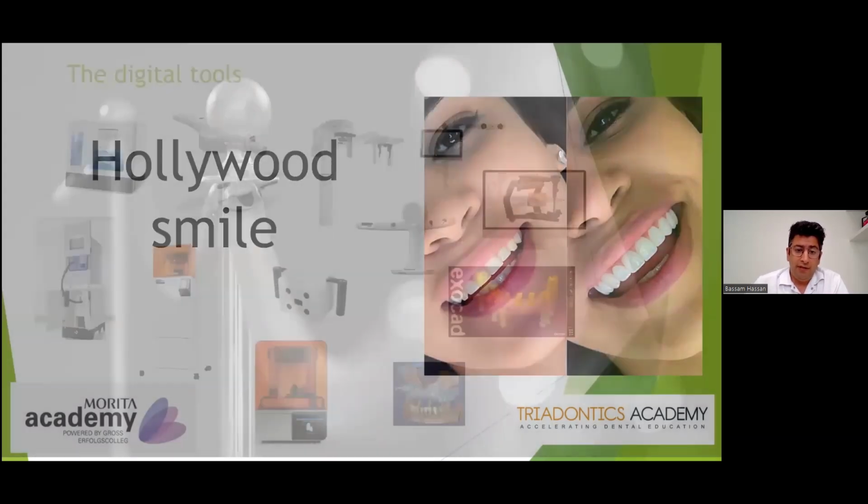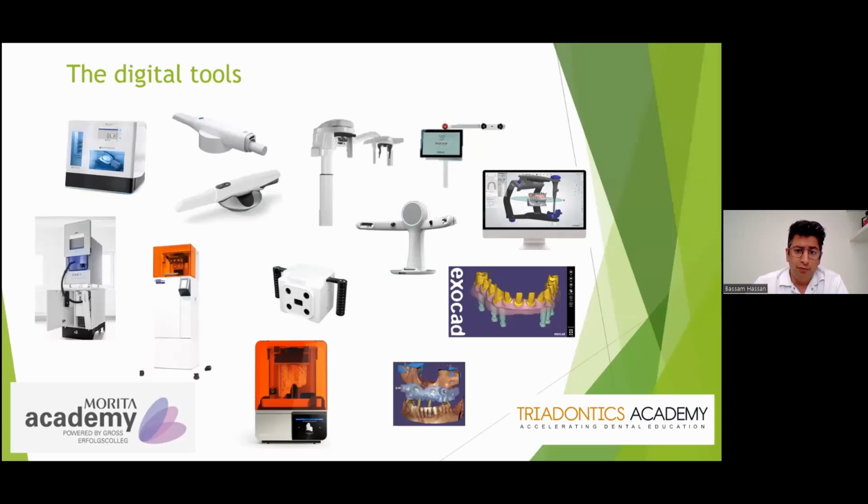And the same thing with the digital tools. If you look at the digital tools that you have at your disposal nowadays, you have too many tools: intraoral scanners, 3D printers, mill units, facial scanners. You need to deal with design software, with digital planning software, DSDs, digital smile designs, and jaw motion trackers if you are into functional dentistry, implant position capture with photogrammetry.